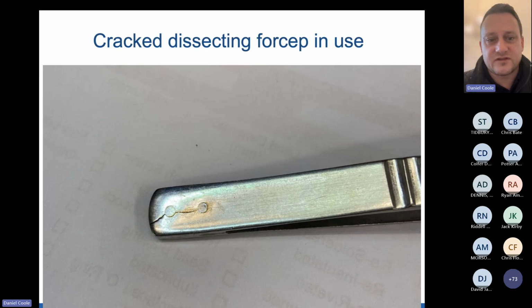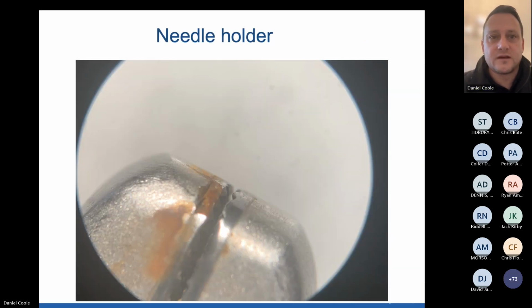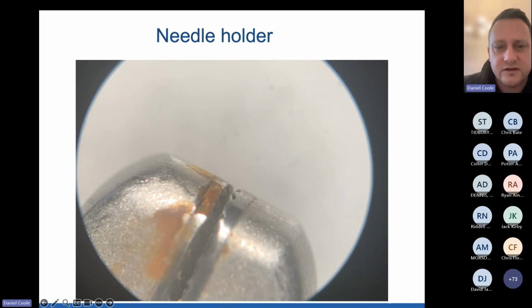Crack dissecting forceps, quite a common thing. We see cracks on dissecting forceps that obviously, again, this is just something to watch and keep an eye on. Needle holder, I mentioned keep trying to look at your needle holders and look at your tungsten carbide inserts. This visually just looked like a rusty instrument on the tip, but when we zoomed in, we could see that the tip was damaged. Some of it's been taken away and it's left an unfinished surface underneath.